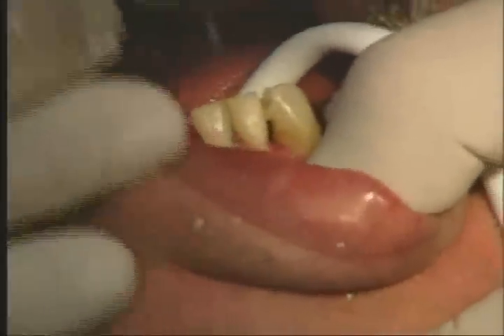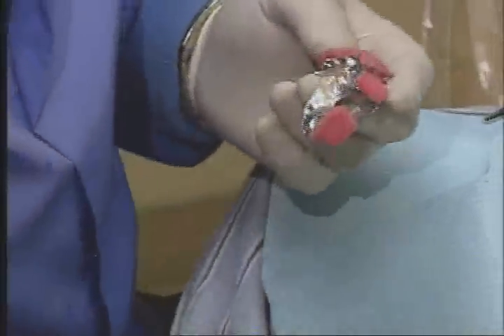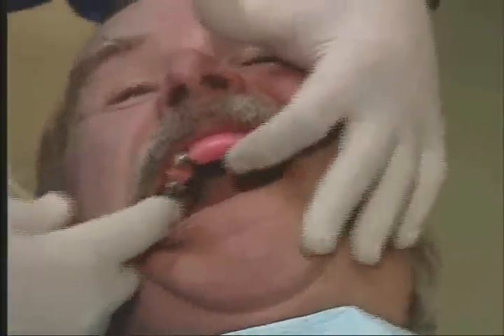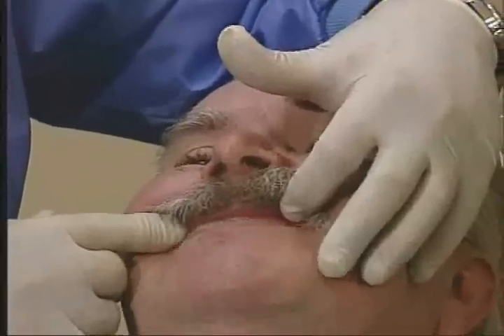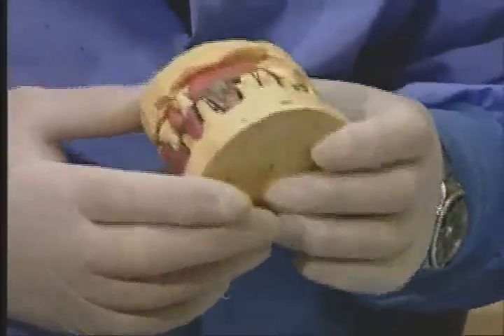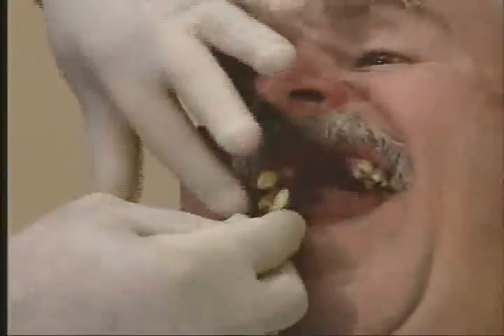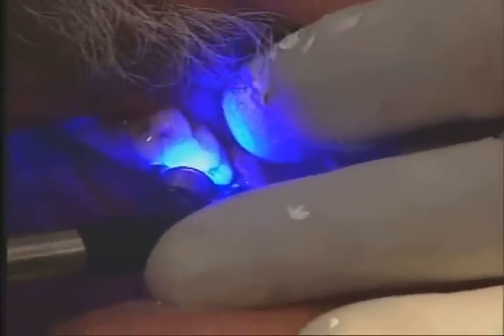Never acid etch. This stage is very important. Visit 3: The Equipoise metal framework is now tried in the patient's mouth. Any prematurities in the area of the prepared rests must be adjusted. A vertical and centric registration is taken and the master cast and counter are returned to the Equipoise certified laboratory for a trial setup of teeth in wax. At this visit the doctor will take a shade of the patient's natural teeth. Before the patient is dismissed, the interproximal space must be preserved by placing a light-cure composite in the prepared area.